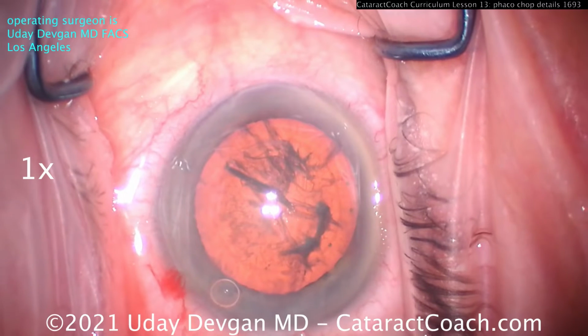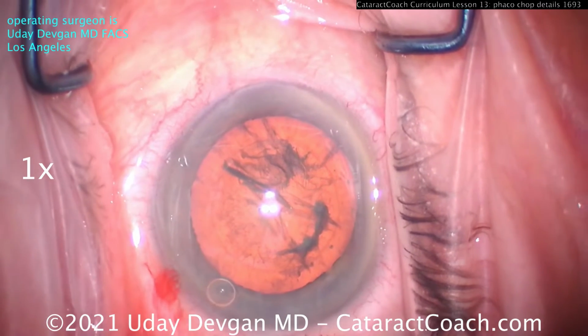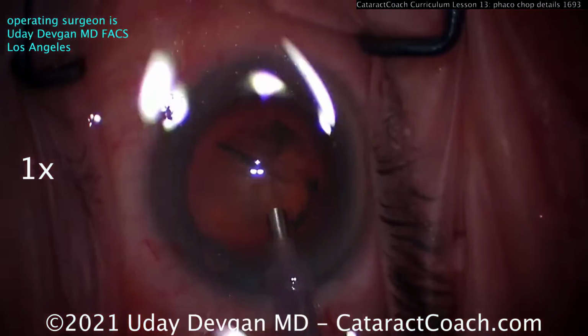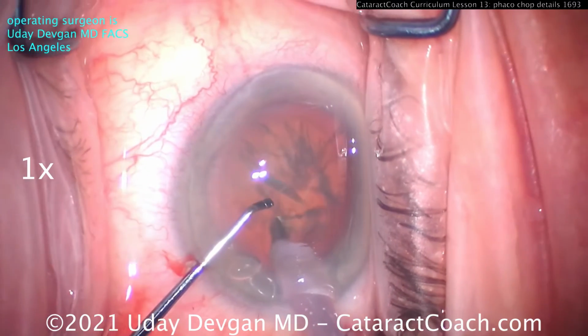Now we'll get the Phaco probe ready. A little tiny dab of viscoelastic there in the center to protect that central corneal endothelium. Here's the Phaco chop mode on the machine. High vacuum, high flow, 400, 500 millimeters of mercury. And now watch where we place that Phaco probe.